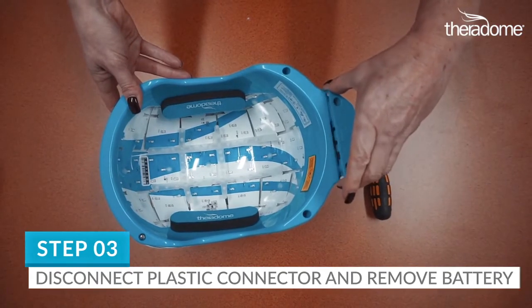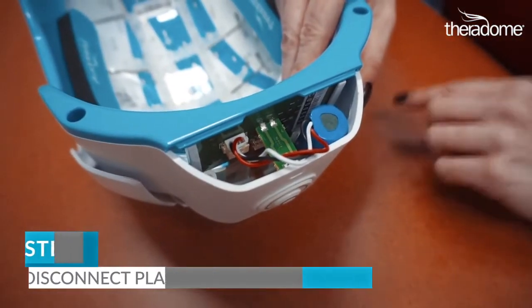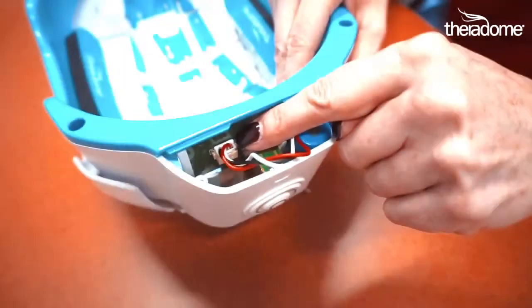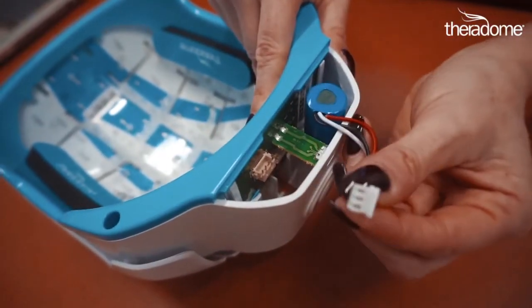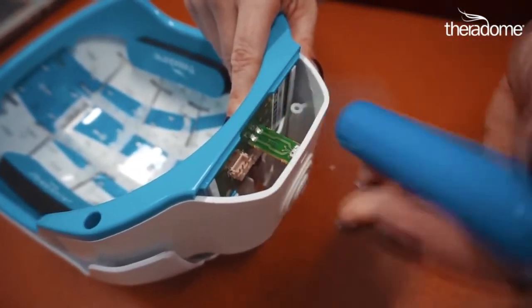Step 3. Carefully remove the battery door from your helmet. You'll see the battery is attached to the helmet via two wires and a plastic connector. Let's remove that. Disconnect those wires by pinching them at the base of the connector and gently pulling them apart.